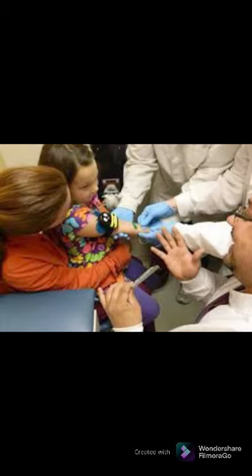And in doing so, you wouldn't have much movement. You can also ask another phlebotomist to assist you in holding the arm so that the child wouldn't pull the arm, causing you to puncture the vein.